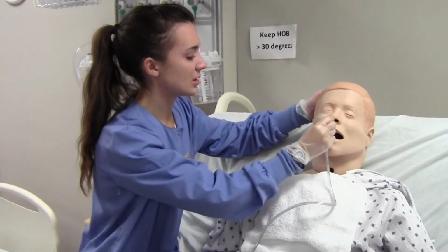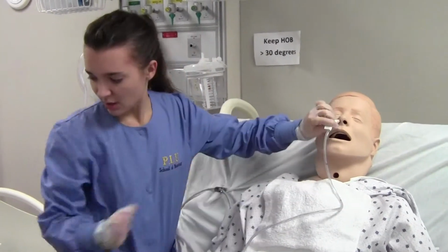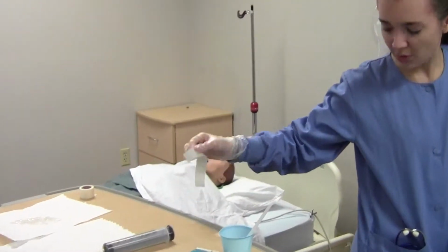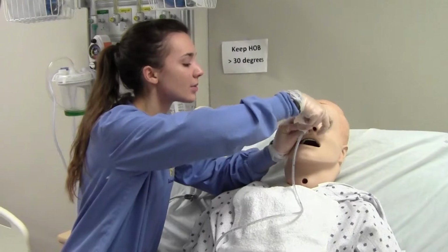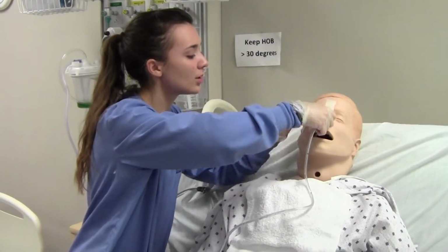Okay, excellent. You can tilt your head back just a little bit. I'm going to put some temporary tape on you right now. I'm going to really try to secure this because we put on quite a bit of lube.